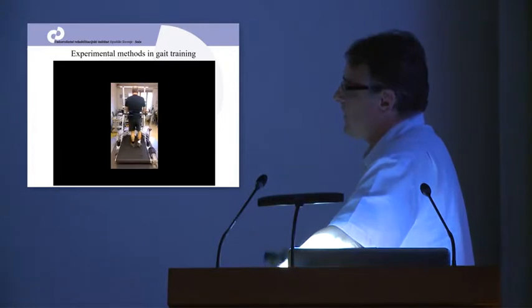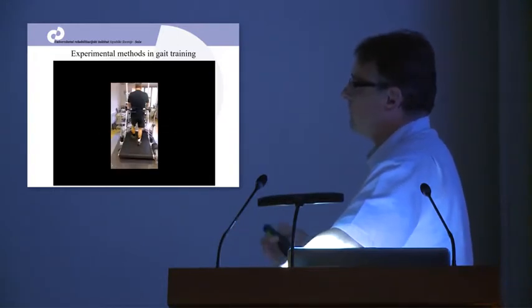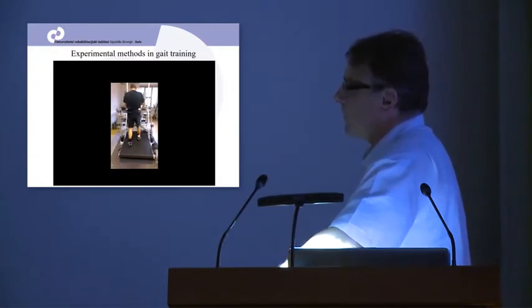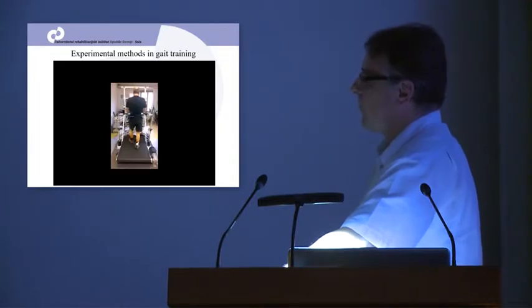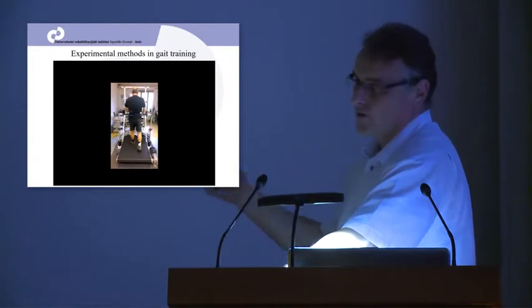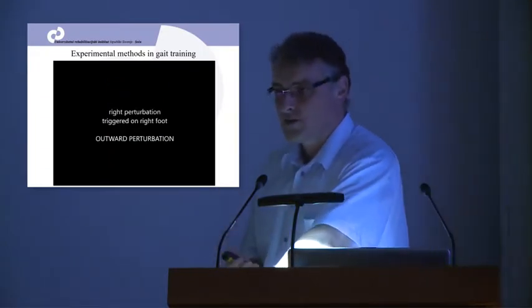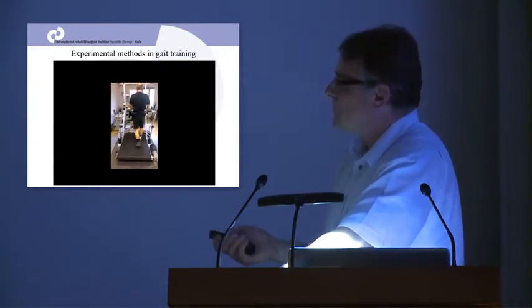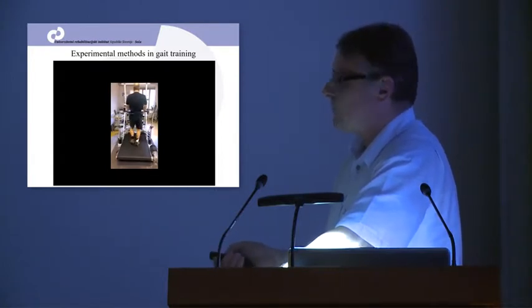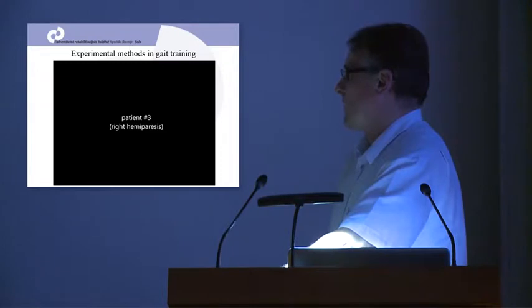With these patients, at the beginning they were capable of walking 15-20 minutes per session. At the end, after 30 sessions spent over 3 months of training, they were able to walk for about an hour in each training session. In an hour of walking, they were capable of performing more than 1,000 steps, either perturbed, training symmetry, or push-off. This number of steps is very difficult to achieve in any kind of training with therapists. And also, as you can see, the variability of this walking is much different than the variability in devices intended for moving the legs of the patients.